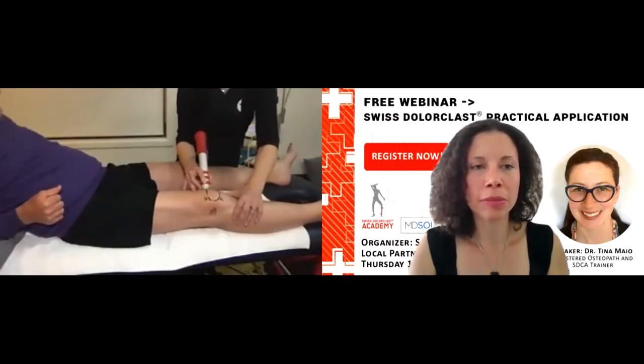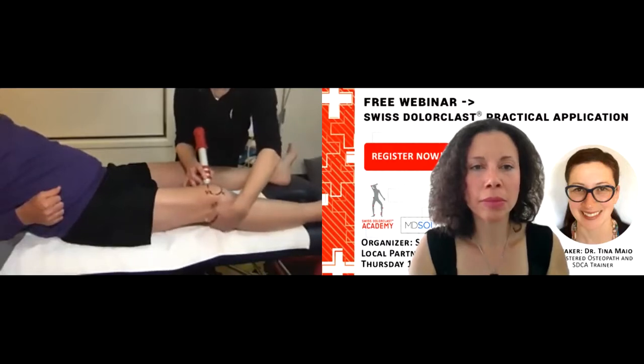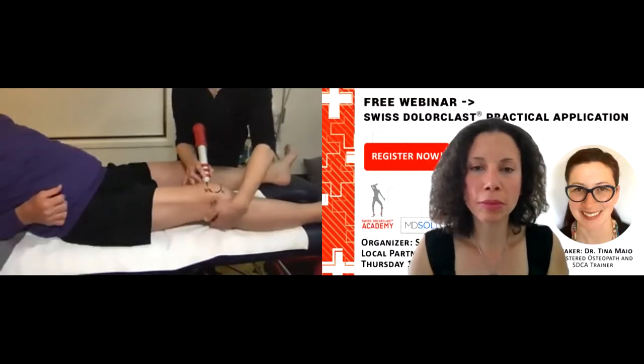Is that referring anywhere? Can you feel that traveling deep into the joint? Good. If I flex the knee slightly, do you feel like it goes deeper? Yes. Yep. So if you can open the joint a little bit and get that blood flow in a little bit further, that's going to be really helpful.